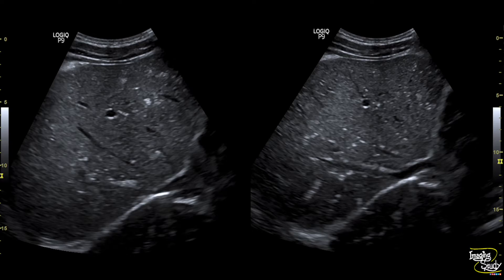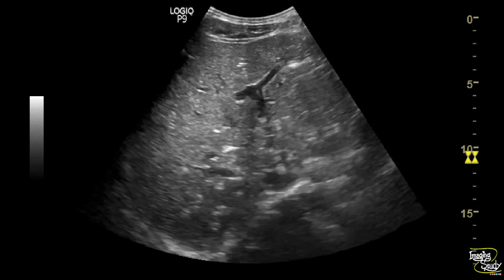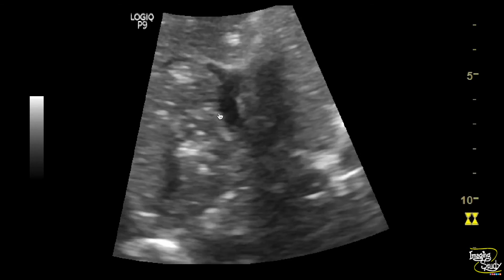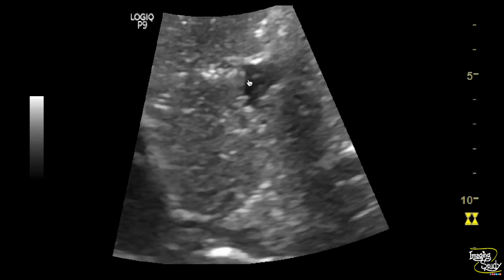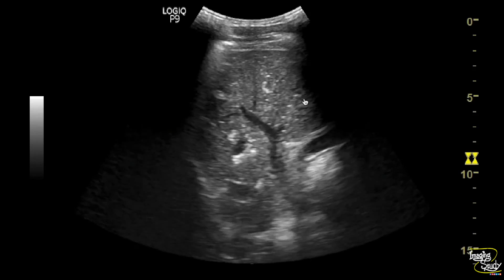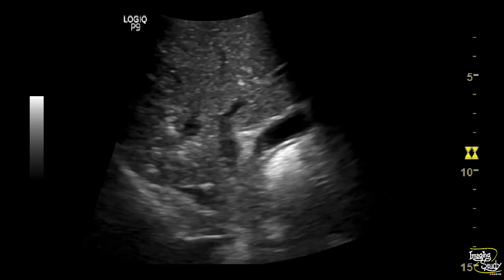Another case recently came in with severe abdominal pain — a young patient of 30 years old. On the liver ultrasound image, the first thing that comes to mind is pneumobilia, so we checked the portal vein. You can see hyperechogenic mobile structures within the portal vein flowing towards the periphery — these are gas within the portal vein. The air droplets are getting entrapped within the peripheral branches, mimicking pneumobilia. You can see a huge amount of gas entering the liver through the portal vein.